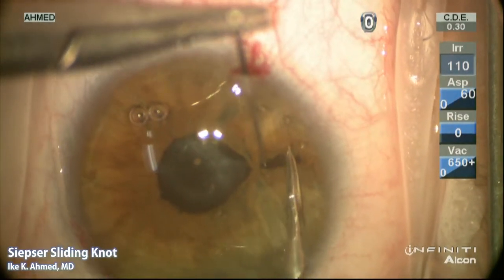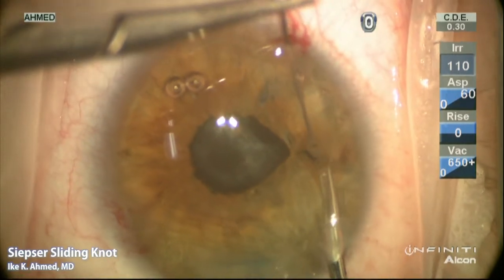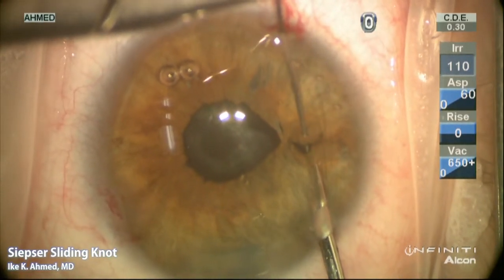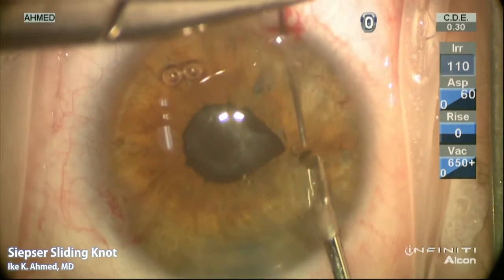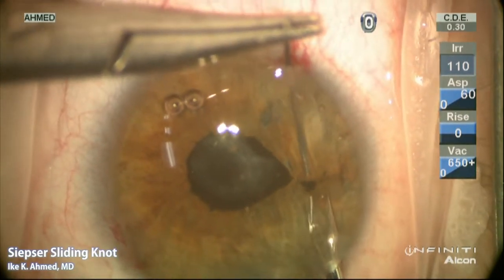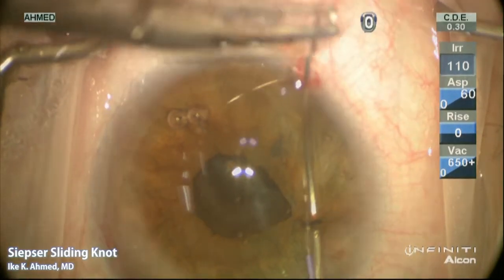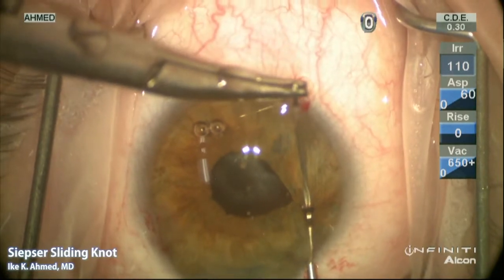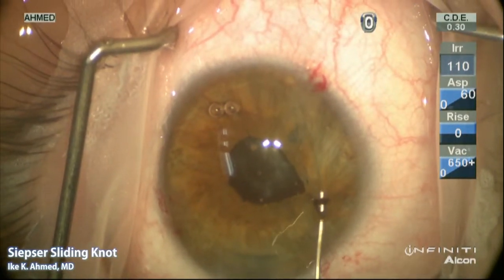A micrograsper is used to hold one leaflet of the iris defect while the needle is passed through the iris, emerging through the other leaflet, to create a pass between both sides of the iris defect. The suture needle is withdrawn through the eye with the use of a 27-gauge cannula, which helps to prevent the needle from being trapped into the cornea.